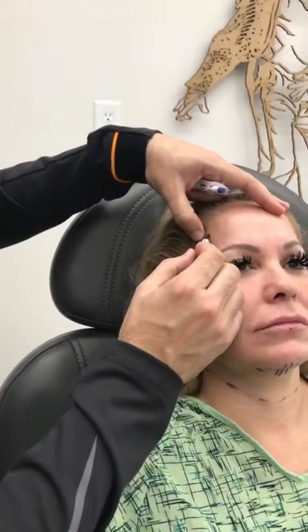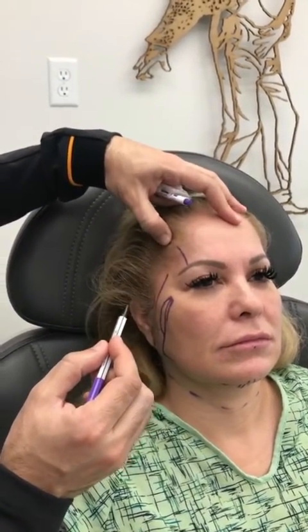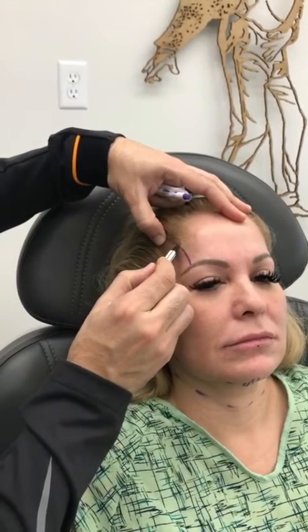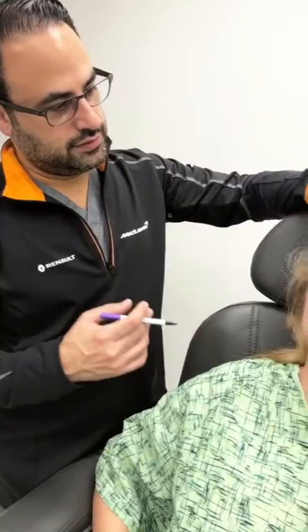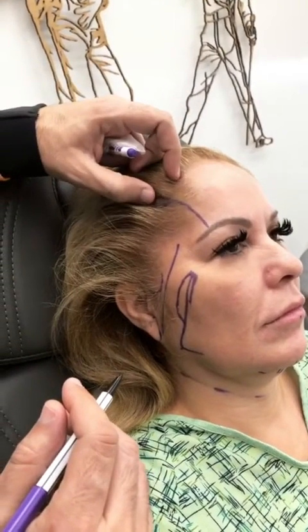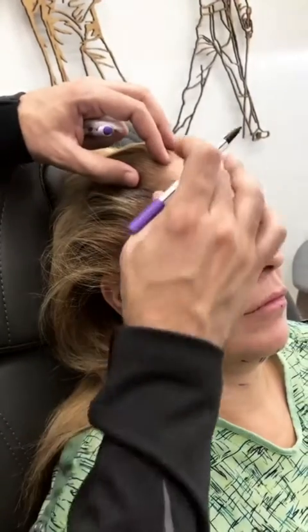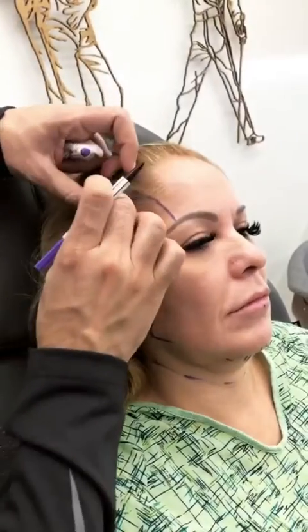Alright, so now we're doing the markings for the brow lift. This is a hybridized kind of brow lift. It's a mix between a lateral temporal lift and an endoscopic brow lift. So she has such a nice low hairline that we can put the incisions anywhere. And right now I'm deciding how to do that. Because she has a bit of a heavier forehead, the single incision that I make here might not be sufficient, so I'm going to do one incision here and then a tiny one up there.